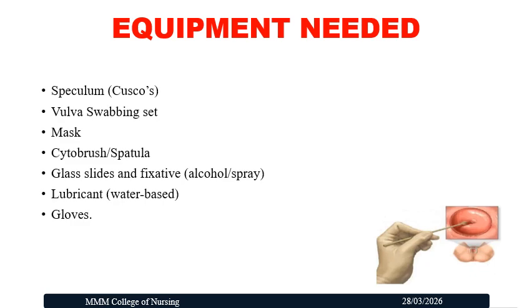Equipments needed are speculum, that is Cusco's speculum, vulval swabbing set, mask, cytobrush or spatula, glass slides and fixatives, lubricants and gloves.